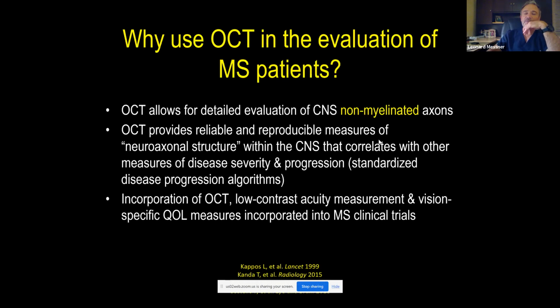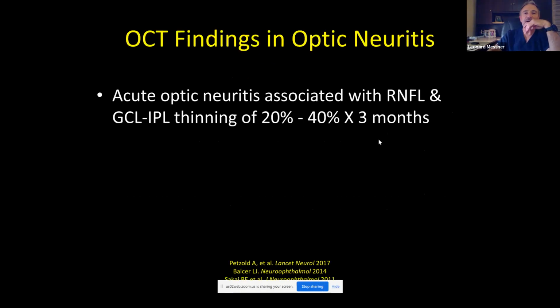So very simply, what does that mean to you as an optometrist? Most of the neurologists you're going to be working with probably do not have OCTs. You're going to be inheriting their patients to do the OCTs, send them the results, and send them a report so that it can go along with whatever is going on with their serial MRI. So we can think about OCT findings in MS, both those with optic neuritis and those without optic neuritis.